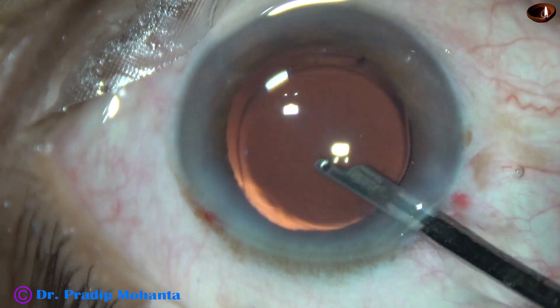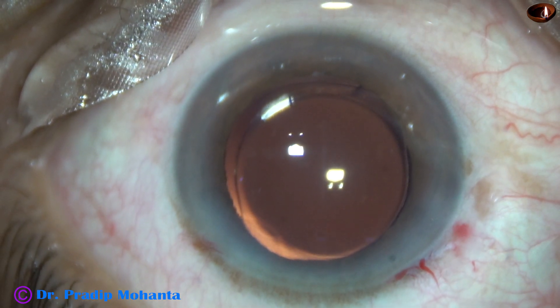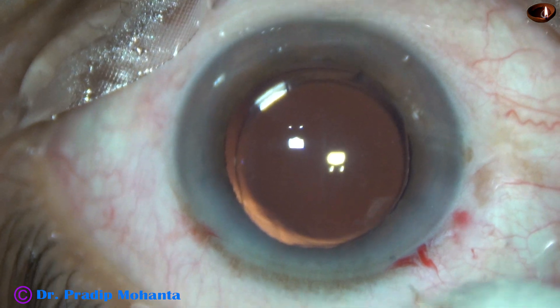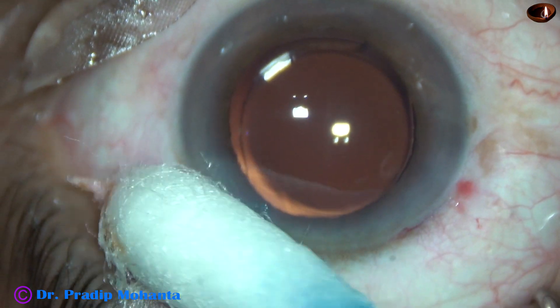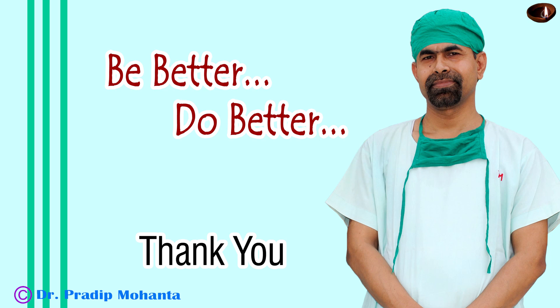The integrity of the wounds is checked — yes, there is no leakage of any fluid from any wound. Moxifloxacin is applied over the cornea and the case is concluded. Note that this hard cataract has been done in less than eight minutes, and it is a totally unedited recording. When you become a competent surgeon, it is possible to do this. Be a great surgeon and serve your patients with love, respect, compassion, and great surgical competence.